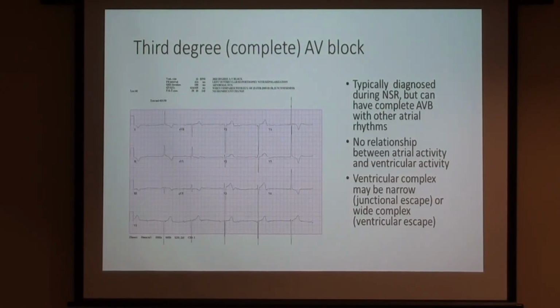Commonly in third degree block, it isn't. Usually it is a ventricular escape as opposed to a junctional escape, but in this case it is a junctional escape. Patient probably has LVH. Look at all that voltage, man. That's some voltage.